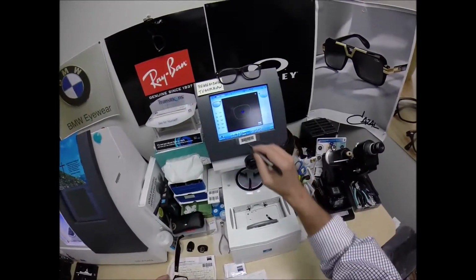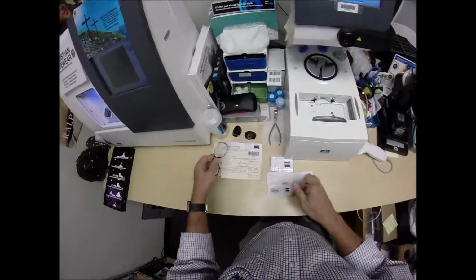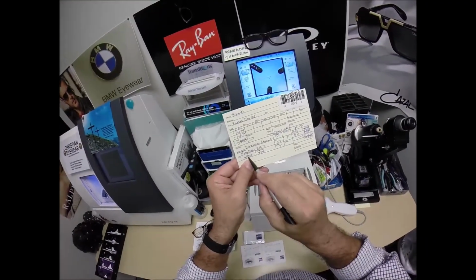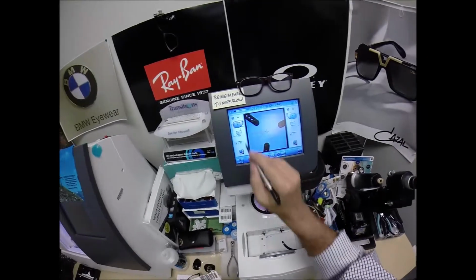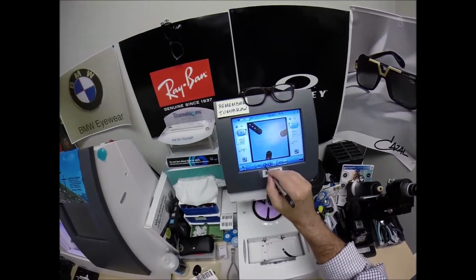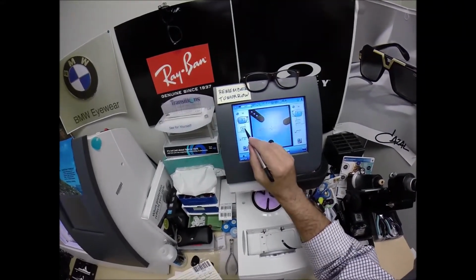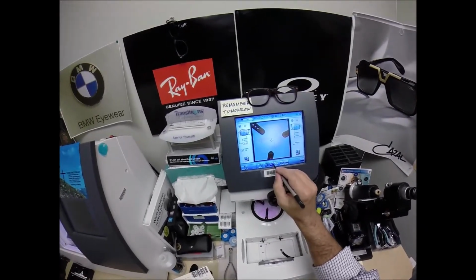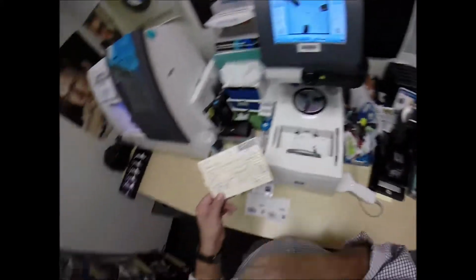Now, that is the shape of the lens I'll be cutting. I'm going to move on to the next screen to enter all the parameters, starting with the pupillary distance, which is 30 for each eye. The computer starts at 32.5, so I'm going to hit the minus button a few times. It goes down in 0.5 millimeter increments to 30. I know from experience I'm going to cut the optical centers at 23.